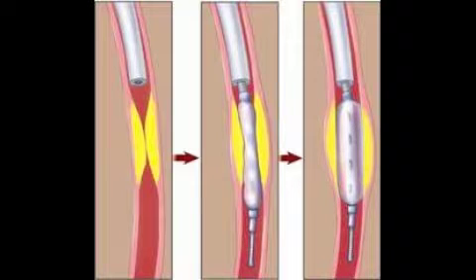As the balloon is expanded, it is also releasing a medication called paclitaxel. The job of this medication is to prevent reocclusion inside the artery. This medication is used because of its rapid uptake and prolonged retention. After the procedure is completed, the physician then designates the patient for a certain amount of time to be observed and then allowed to be released home.